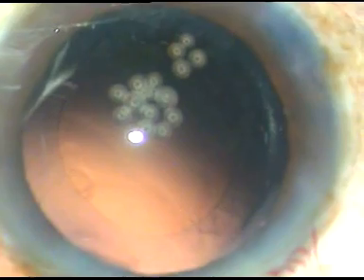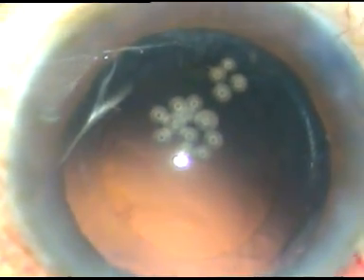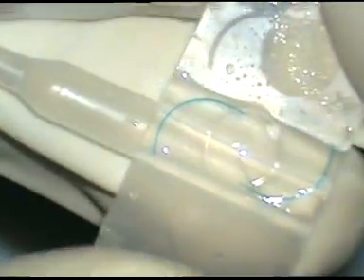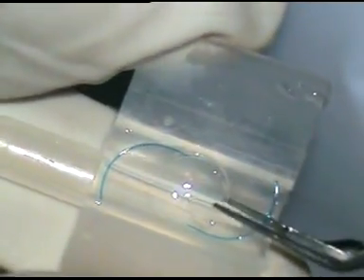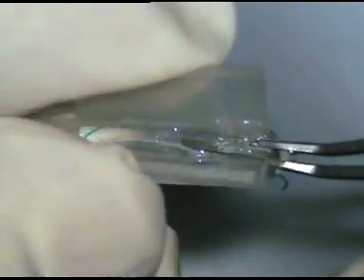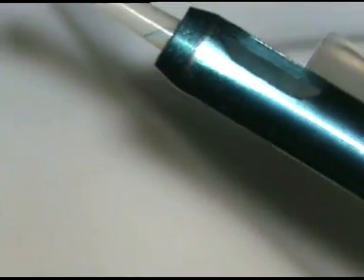In this case I have selected a multi-piece intraocular lens — a Sensar multi-piece intraocular lens. Viscoelastic substance is injected into the anterior chamber and the main wound is enlarged a bit. This is how you place it in the cartridge — the optic goes under the ridges. Close the flap, place it on the groove of the injector, and this haptic should project outward. Push the plunger and the haptic should advance up to this point.